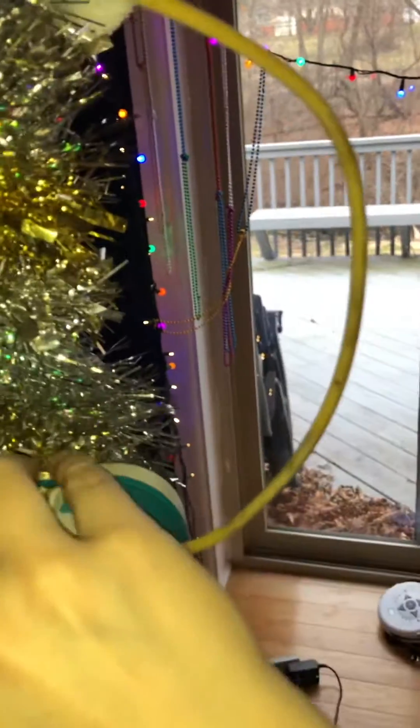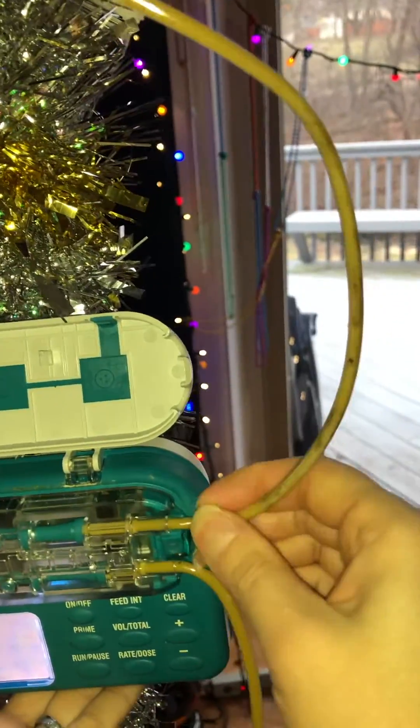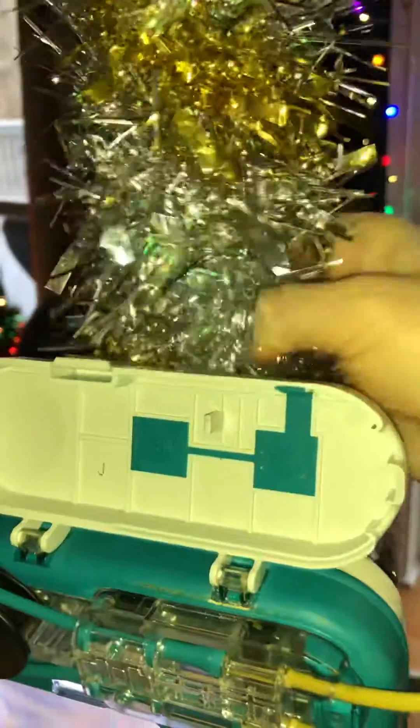I'm gonna loosen the clamp on the back of the pump and shift it up some so I have a little bit more of a bend. I'm gonna try to shift it — all this tinfoil is in the way. We're gonna push.